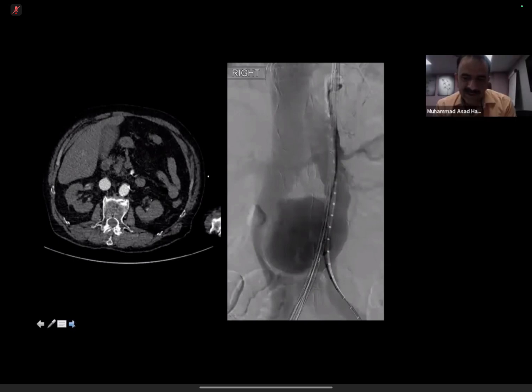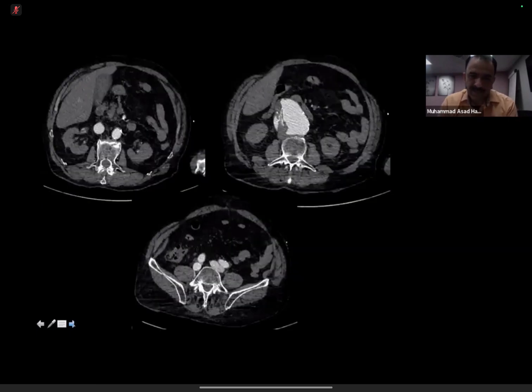Contrast has been injected into the aorta, as you can see from the renal arteries becoming highlighted with that contrast. Contrast is pooling into the aortic aneurysm sac, and then you can see the contrast in the IVC as well. Okay, this is one of the classic cases, having the contrast density the same in aorta and IVC.